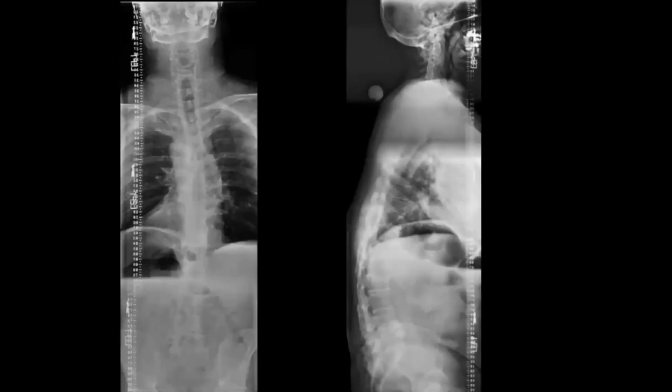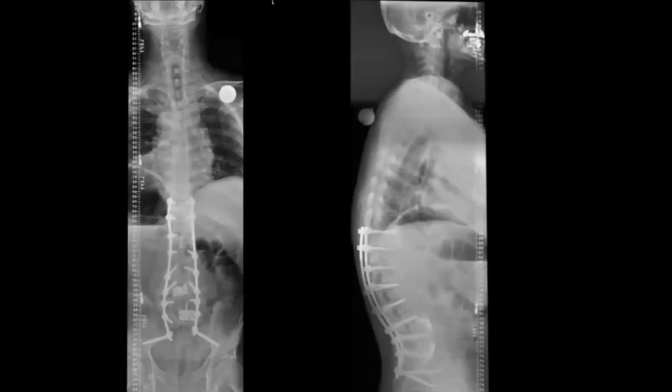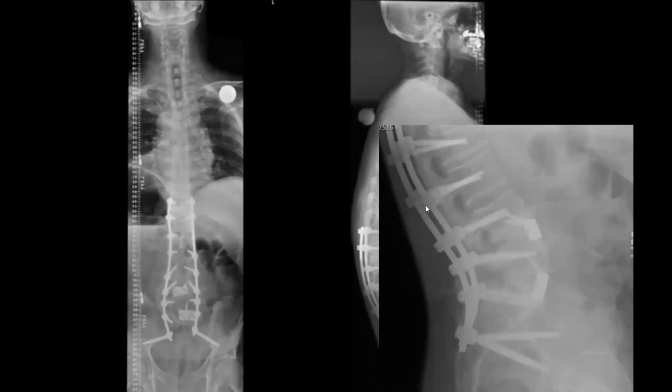Yep. We don't have much time, so I'll show one more case briefly, a very similar theme, but this is a patient with more of a primary deformity without the implants in the back. But again, what I want to emphasize here is my goal in reconstructions is to really try and induce lordosis from L4 to S1. And again, this is a similar technique. In this case, again, using the unilateral screws, getting lordosis, in this case almost 40 degrees of lordosis from L4 to S1, really trying to get most of my distribution of lordosis there. That's an important strategy to avoid junctional kyphosis.